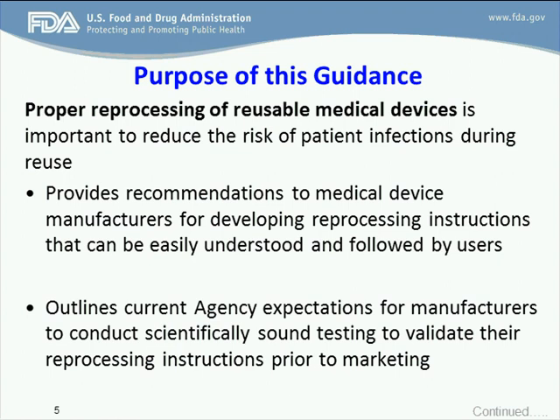So, what is the purpose of this guidance? As we know, devices that can be reused are commonplace in healthcare settings. To reduce the risk of patient infections during reuse of these devices, it is important to reprocess them properly between use. And a device manufacturer's reprocessing instructions are critical to ensure their proper reprocessing.